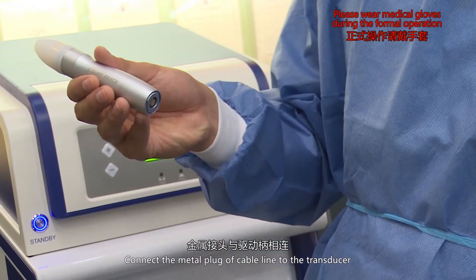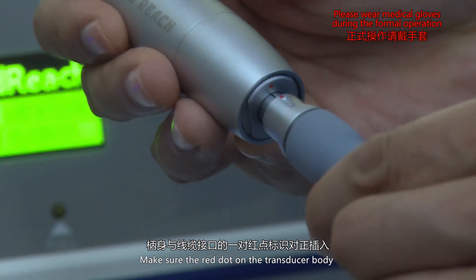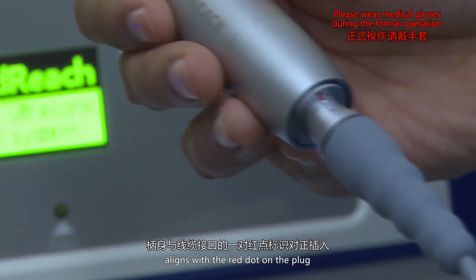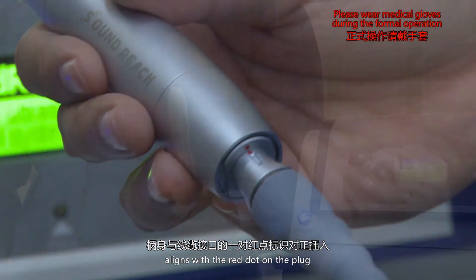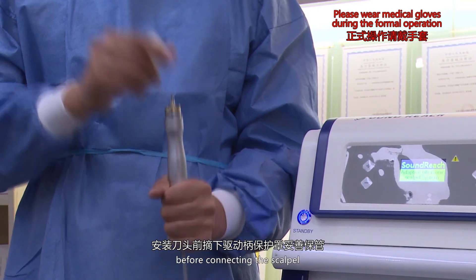Connect the metal plug of the cable line to the transducer. Make sure the red dot on the transducer body aligns with the red dot on the plug. Take off the protective cover and store it in a safe place before connecting the scalpel.